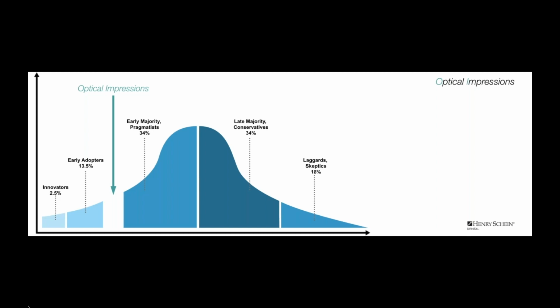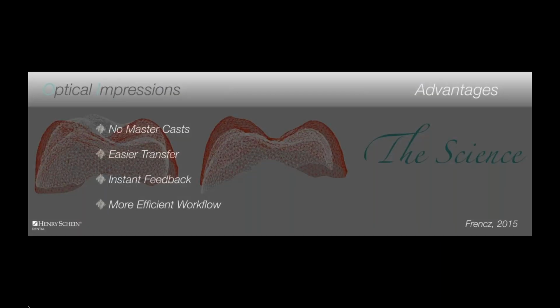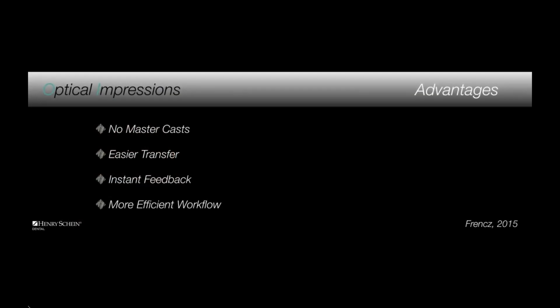So when we look at these concepts like CBCT and intraoral scanning, we want to make sure that there's a baseline that we all understand, and that is really the science behind it. We want to make sure that everything that we do is steeped in evidence-based dentistry and that it works. And when we look at the literature, and let's take intraoral scanning to start with, when you look at the literature of optical impressioning, we know clearly that there are significant advantages to using IOS in dentistry.